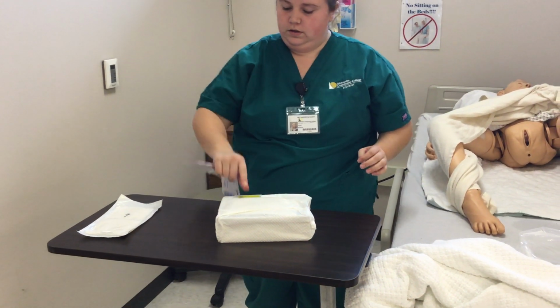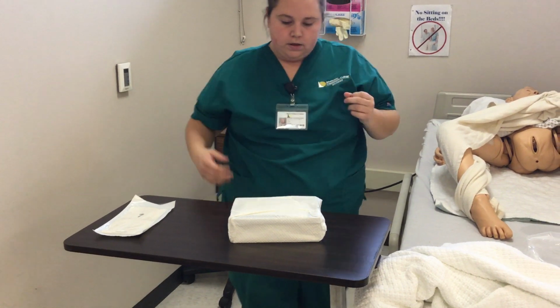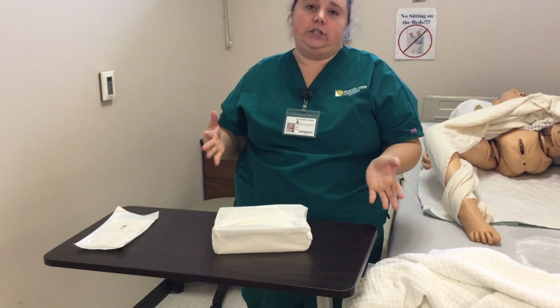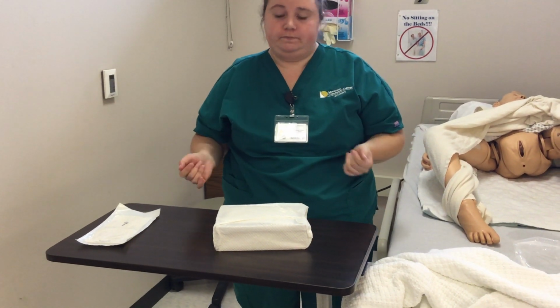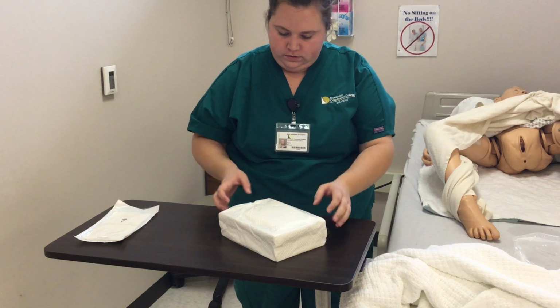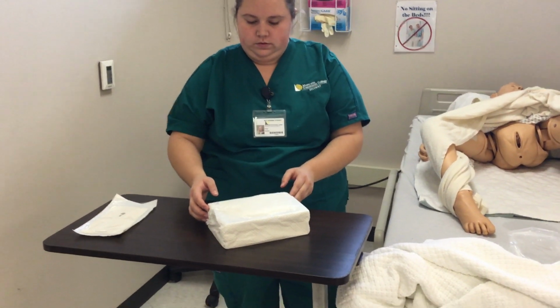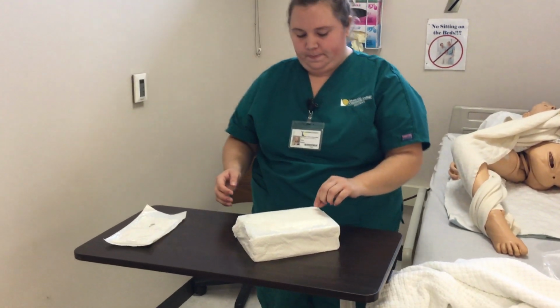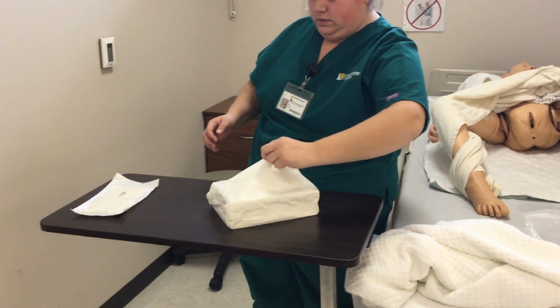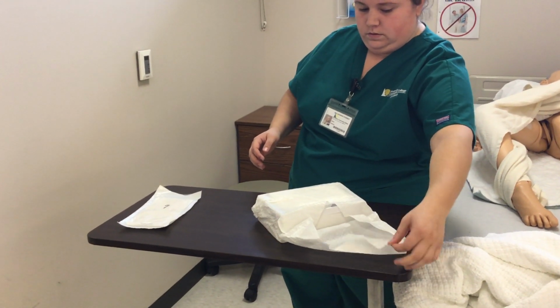Apply gloves and perform hand hygiene. So, at this point, just for precaution, I would perform hand hygiene. Palpate the patient's bladder for signs of distention. So, feeling everything feels good. Then we can also use a bladder scanner. If so, we're going to take off our gloves, wash our hands, perform hand hygiene, and then reapply new gloves if necessary.